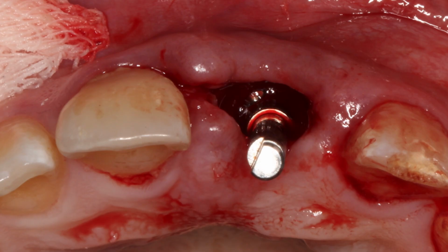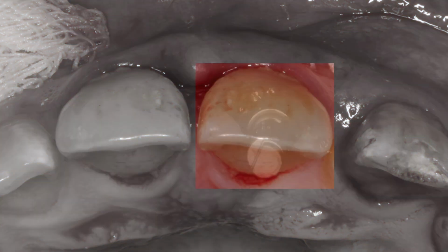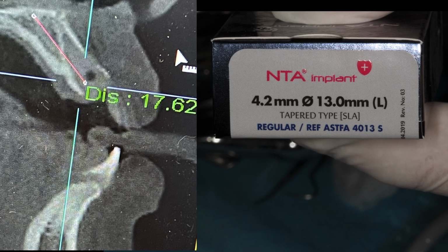So hence, this is the result that we celebrated. Now here on just my keynote, I've simply copy-pasted the existing tools and replicated in mirror image, so that looks like that's a very sound position. So let's look at what's going to happen when we place the implant.